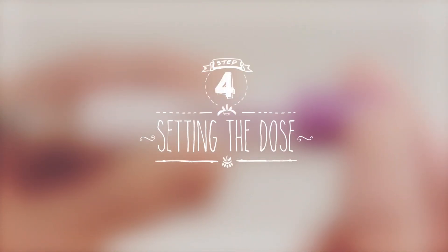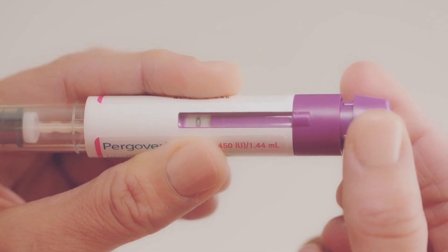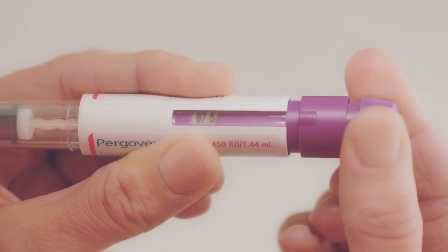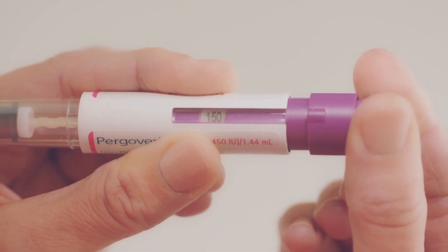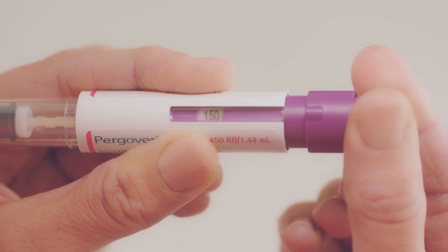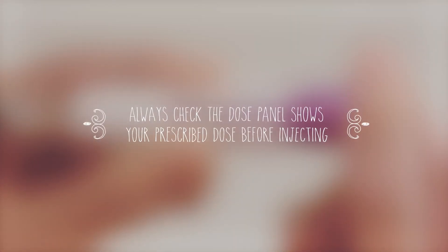Now we're ready to set the dose. Check that the dose window reads zero. Turn the dose knob until your prescribed dose appears in the dose window. Turn the dose setting knob forward to dial up and backward to correct the dose if needed. The numbers in the dose window show the dose of foliotropin alpha, which is one component of Pergoveris. It's important that the dose window displays your accurate prescribed dose before you move on to the next step.